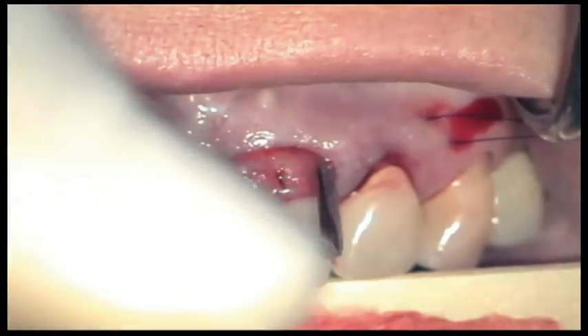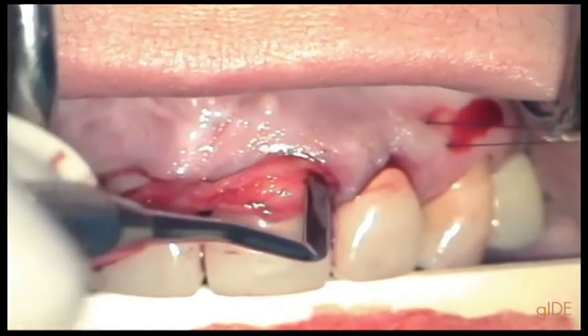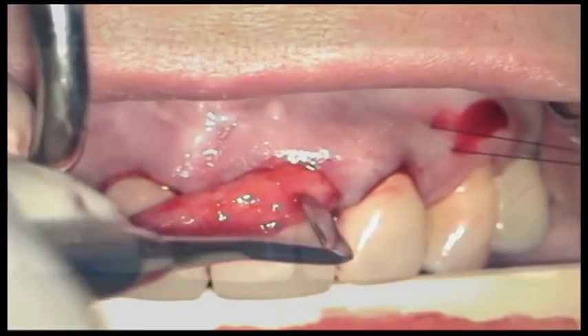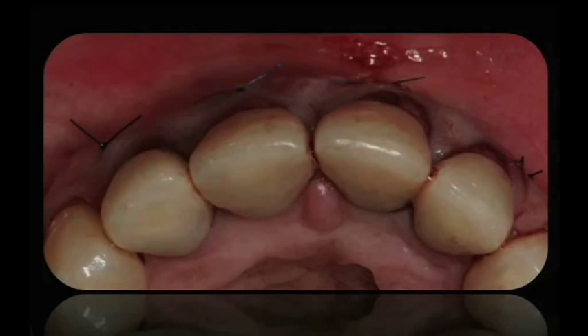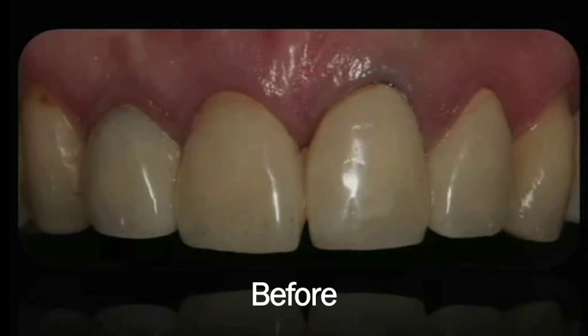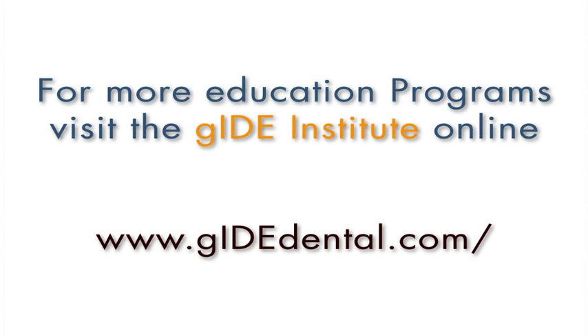Like trying to convince the graft to get into that envelope. And here you can see the results right after the surgery, and here the result two months after the surgery. For more education programs, visit the Guide Institute at www.guidedental.com.